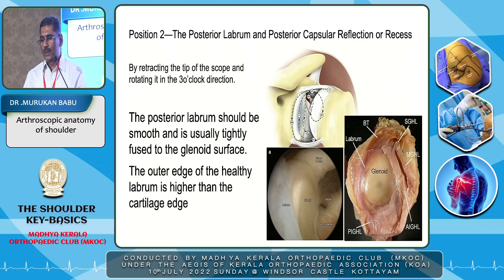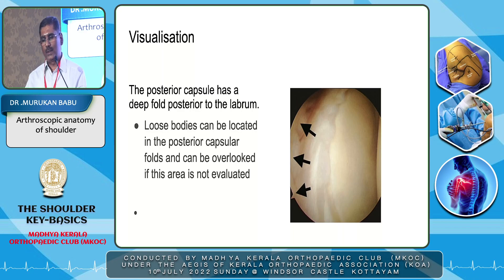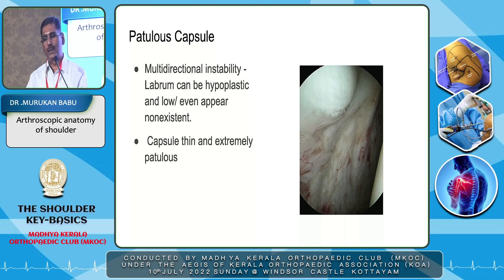Coming to the second position — you come back from the first position to see the posterior capsule and the posterior labrum. The posterior labrum should be smooth and is usually tightly fused to the glenoid surface. The outer edge of the healthy labrum is slightly higher than the cartilage edge. The posterior capsule has a deep fold posterior to the labrum, and in this area you may be able to see loose bodies — but most of the time you may miss these if you are not carefully looking at the posterior aspect. Sometimes you can see a lax capsule, especially in multi-directional instability, where the labrum can be hypoplastic or even appear non-existent.